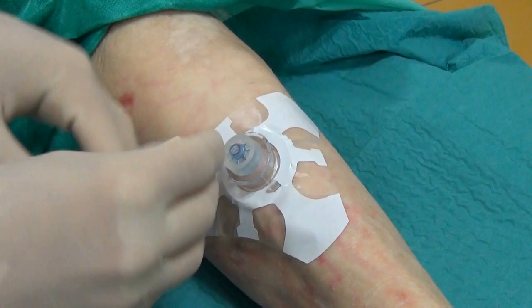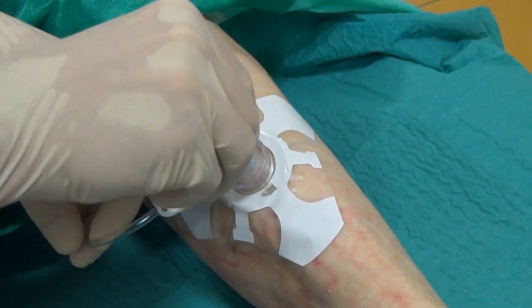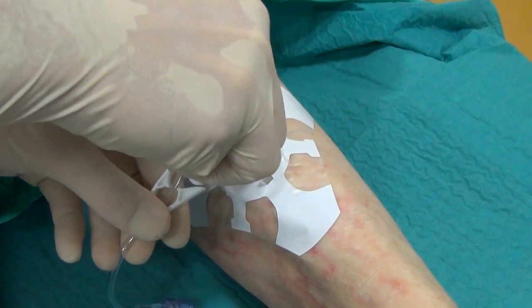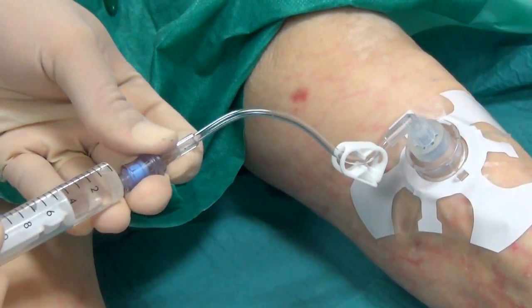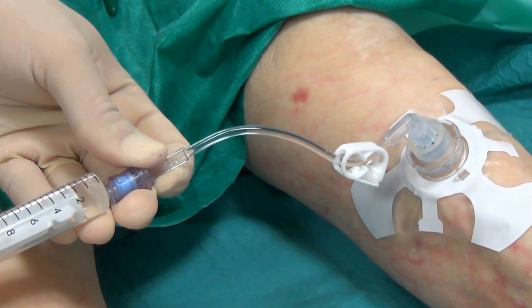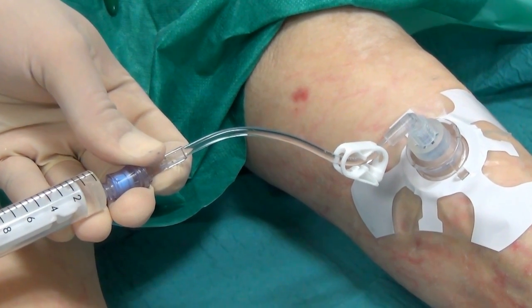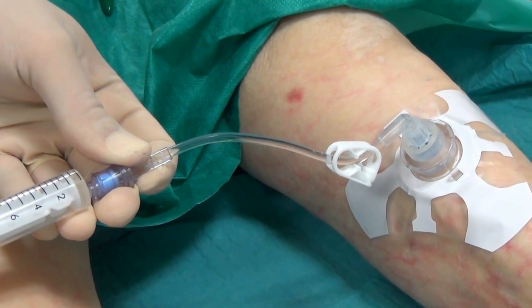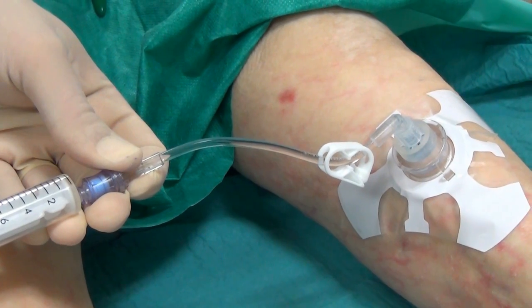A specific dressing can be used. To finish, connect to the infusion line. The tibial proximal intraosseous axis can easily be used.